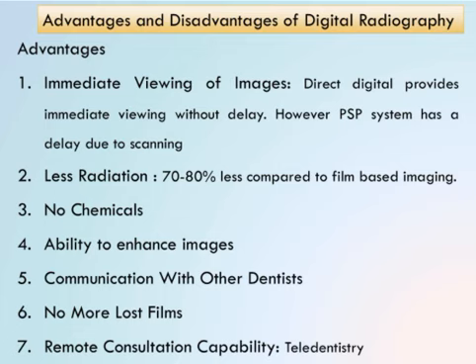Communication with other dentists can be done with the help of emails or other social media platforms. Then no more lost film. That means you need not preserve the hard copy of the film. You have the soft copy, and you can print it anytime it is required. Remote consultation capability is called tele-dentistry.